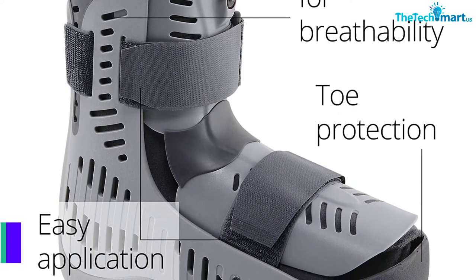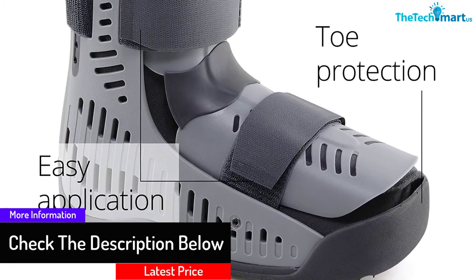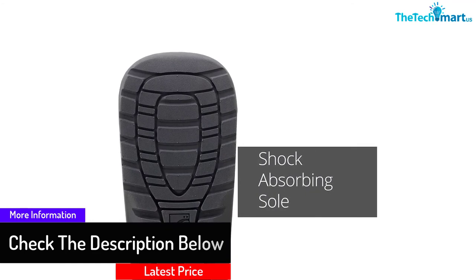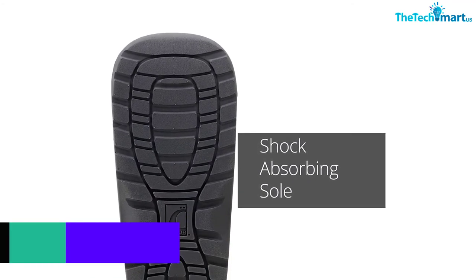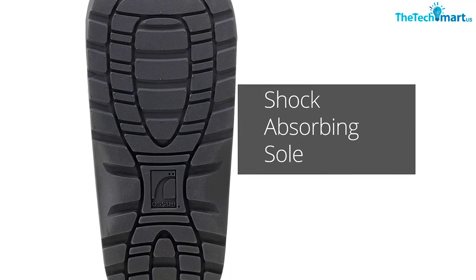Furthermore, the integrated air pump and release valve offer quick and stress-free inflation. Therefore, you can prevent the accidental mobilization of your leg, foot, and ankle. The stable compression keeps the bladder inflatable for years.